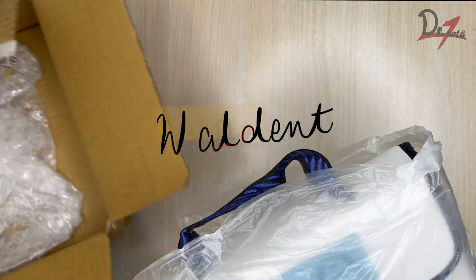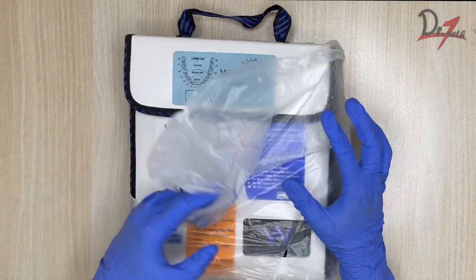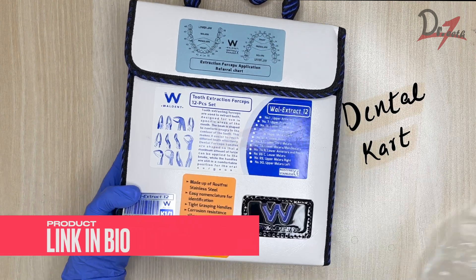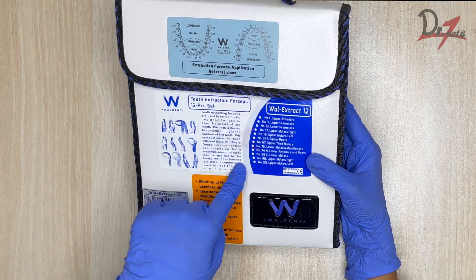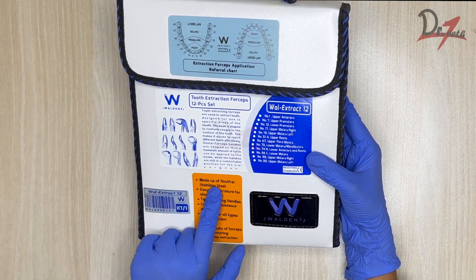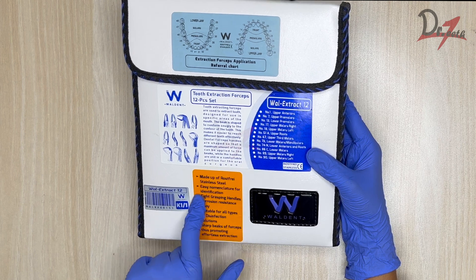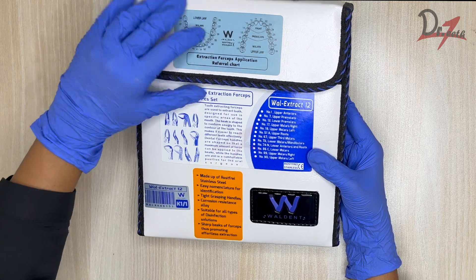Here we have the extraction forceps from the brand Valdent. I ordered this from Dental Cart. We have a 12-piece set here. Everything is mentioned on the packaging — it is made up of stainless steel, with easy nomenclature for identification, and various benefits and specifications are listed.